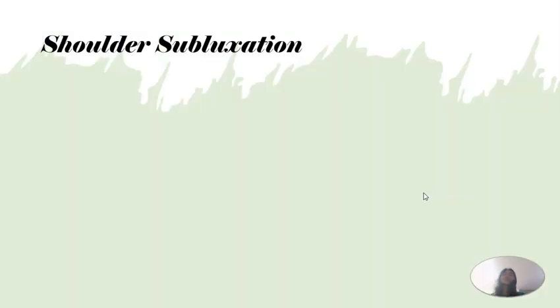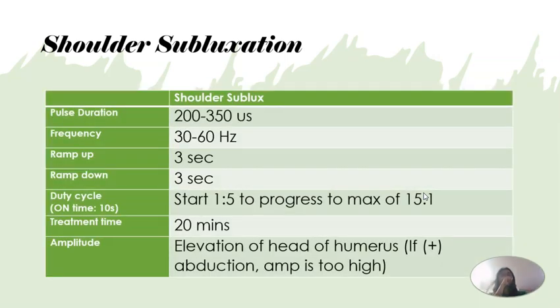Now let's go to your shoulder subluxation. Please take note of the parameters because once you go for your face-to-face, we will go back to all of the parameters that we have talked about, so you can demo quickly during the face-to-face session. These are the following parameters. You can pause the video to copy the parameters.